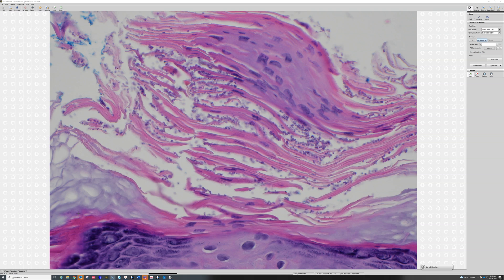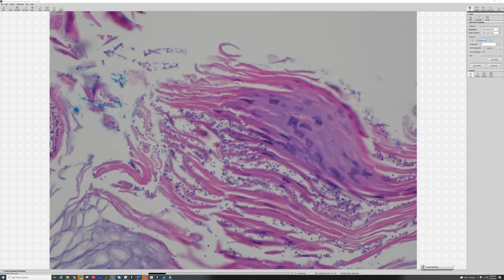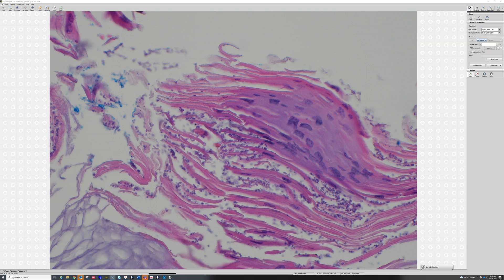Unlike a lot of fungi that look clear on hematoxylin and eosin stain, Malassezia slash Pityrosporum yeast are a purplish color — they're usually easy to see on a regular H&E stain, even without a special GMS or PAS fungal stain. Candida yeast look almost identical to these. They're not causing a problem — they're just growing here, hanging out, and I don't even mention these in my report because it's essentially a normal finding.